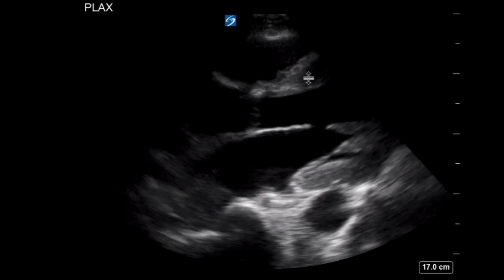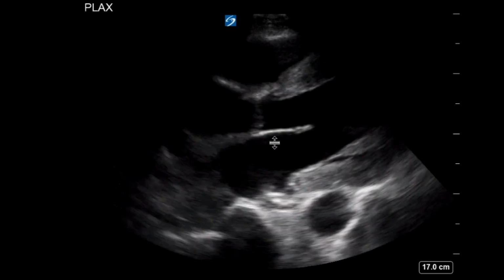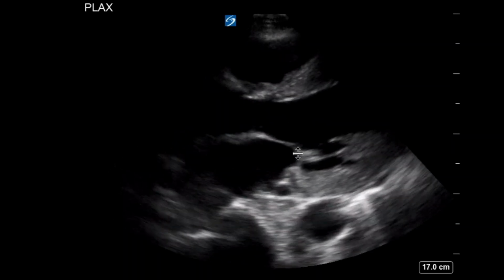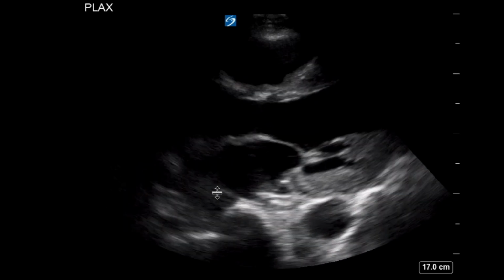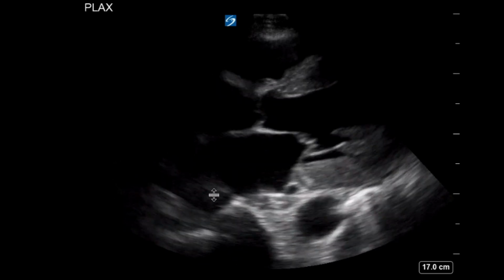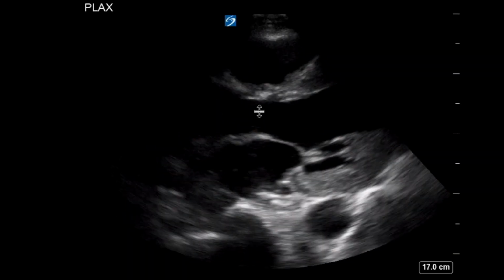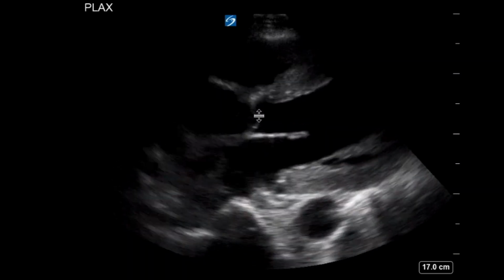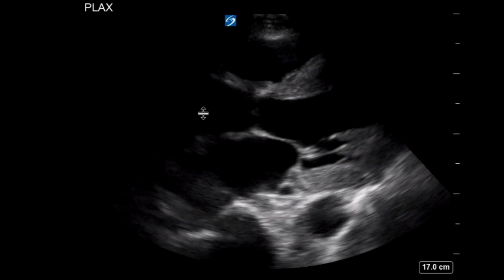And then let's point out some key anatomy that we're seeing here. So this chamber here outlined, what is this? That's our left ventricle. And then we have something moving here. It looks like a valve, and that's the mitral valve. Mitral. Up here we have? That's the left atrium. So what's coming through the left atrium through this mitral valve, and then ejecting through this valve here? That's our aortic valve. Aortic valve, right. And you have the left ventricular outflow tract going into the proximal aorta there.